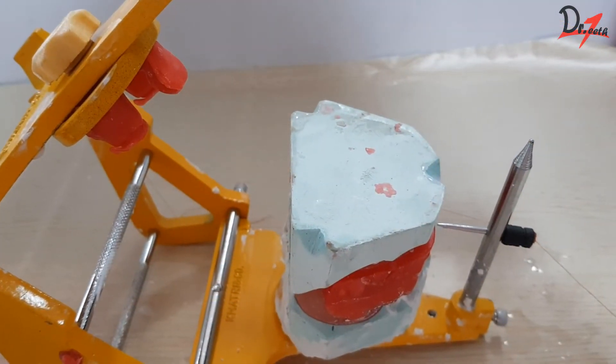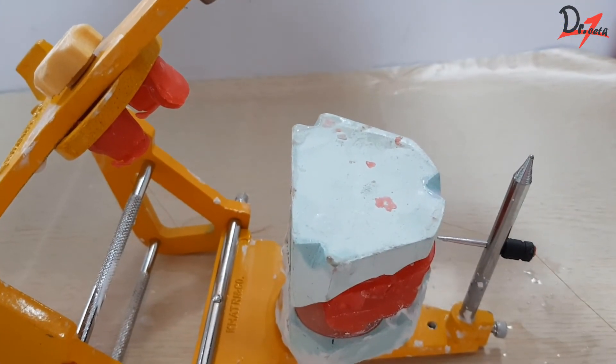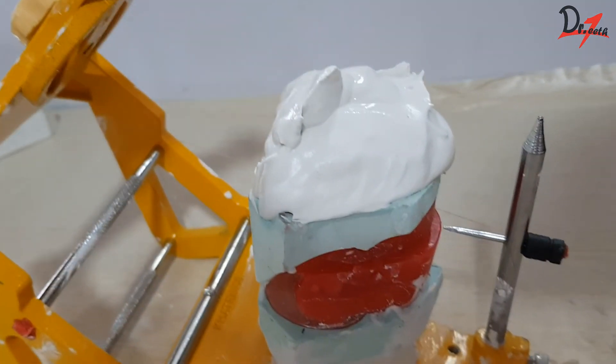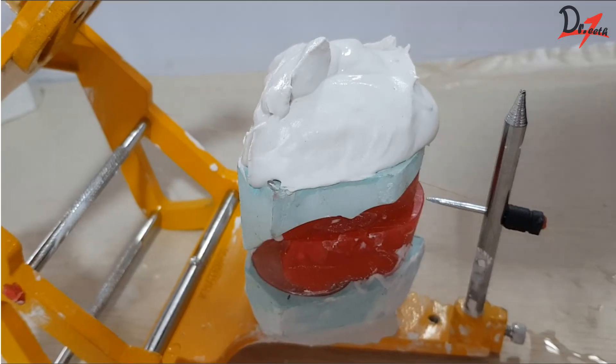Then, keep the articulator upside down, remove the modeling clay and repeat the process. Make sure you apply Vaseline to the notches of the cast for easy separation during processing.